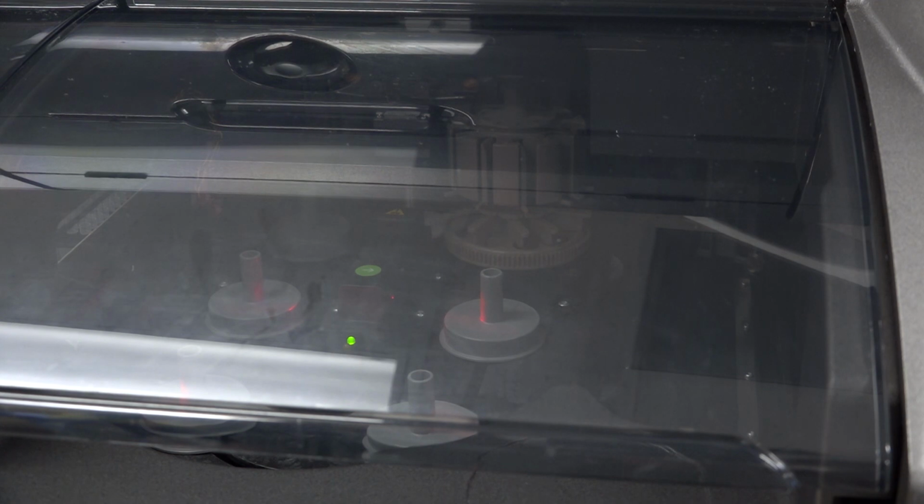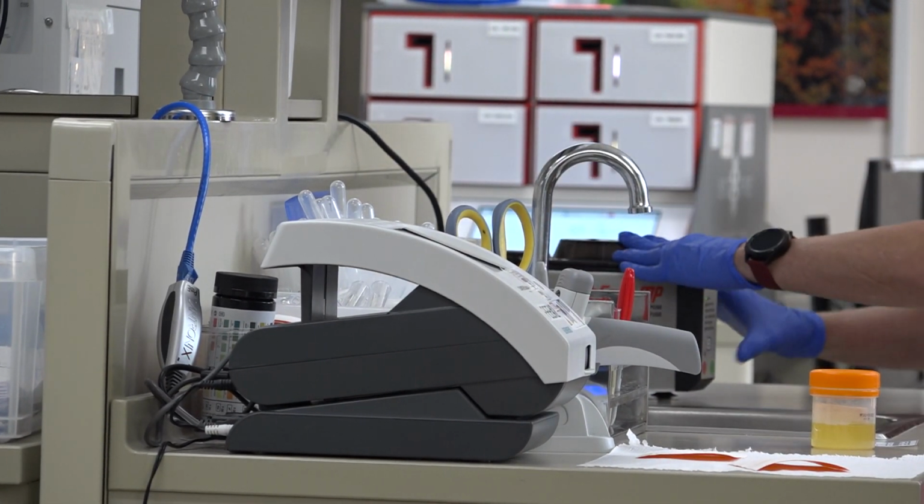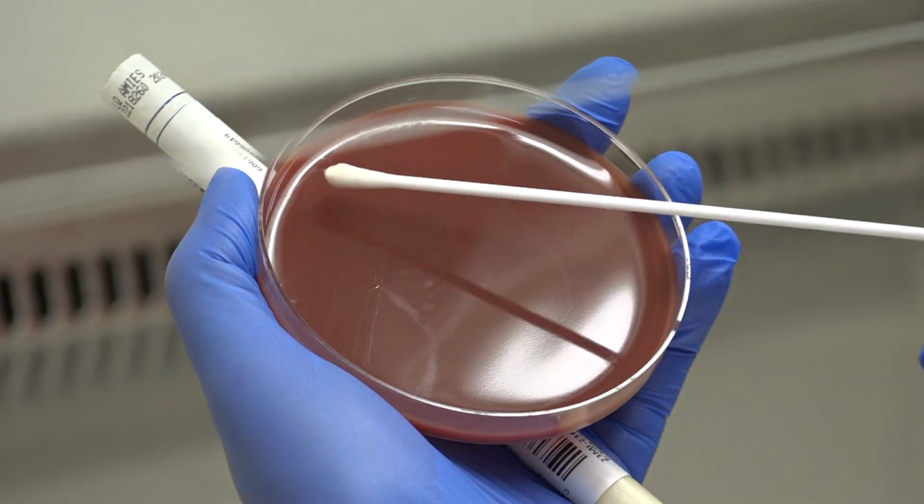One of the biggest challenges the staff here faces is keeping all of the instruments running and calibrated. We have maintenance and quality control we have to do every day. Sometimes these instruments will go down and engineers will just be walking us through how to fix them over the phone. So we get to be an engineer. We validate each instrument before we put patient results on there. So there's a lot more that goes into the machines than most people know.